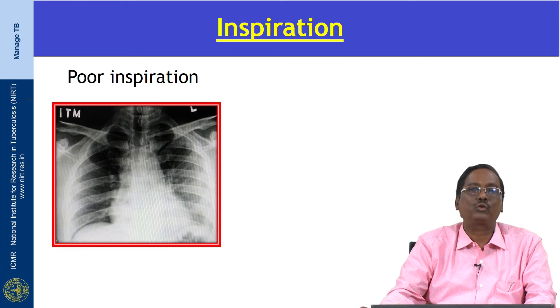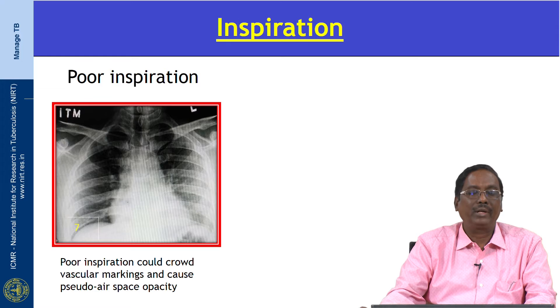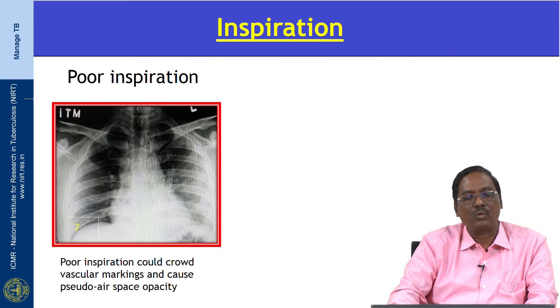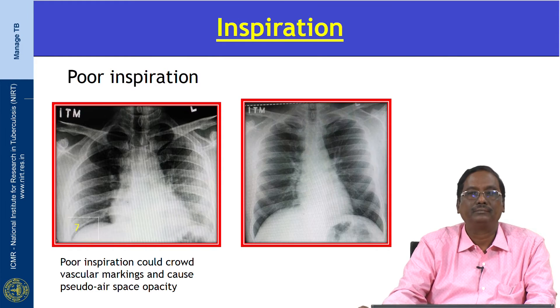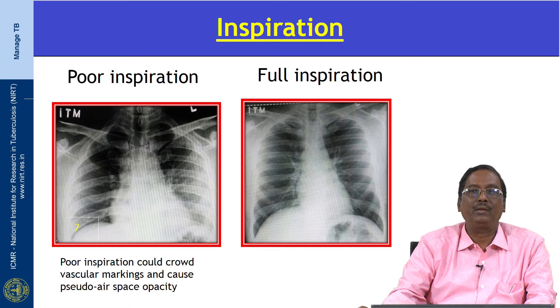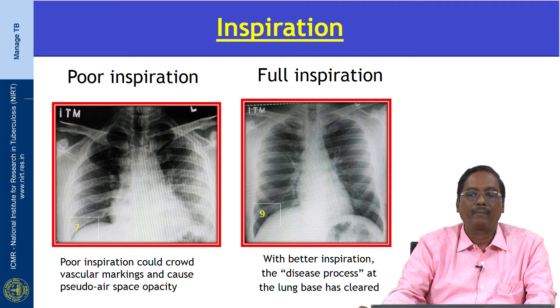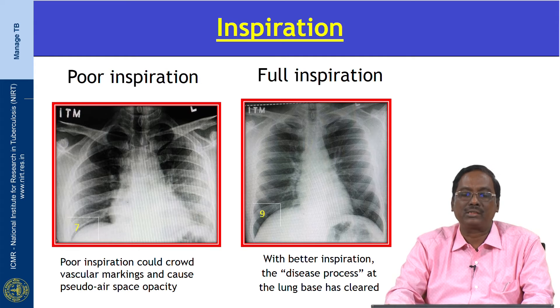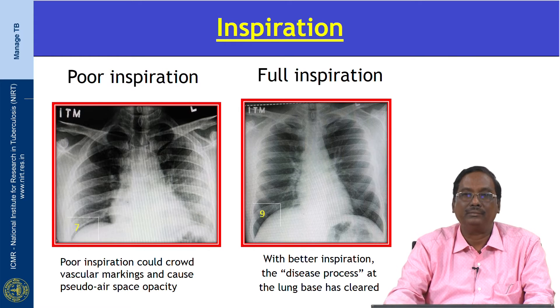This X-ray shows poor inspiration. Poor inspiration could crowd the vascular markings and cause pseudo-airspace opacity. This other X-ray is taken at maximum inspiration — with better inspiration, the disease process at the lung base has cleared.